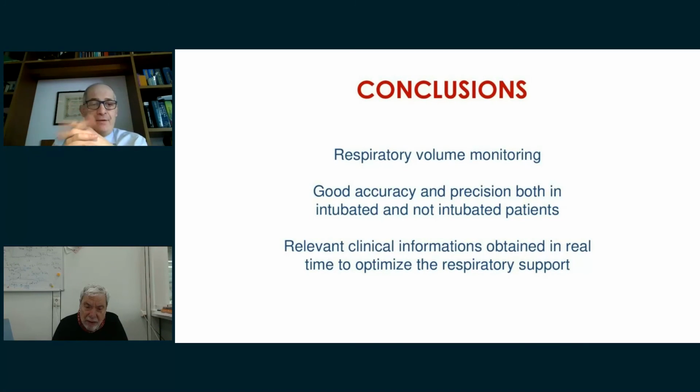But the problem is that it's difficult to have an exact number, because sometimes there is no relationship, especially in COVID patients, between the respiratory rate and inspiratory effort. As Professor Gattinoni told us, we sometimes have big surprises, because the patient seems quite well, with a low respiratory rate and not too big a tidal volume. Then we insert the esophageal balloon and we find a very high inspiratory effort.